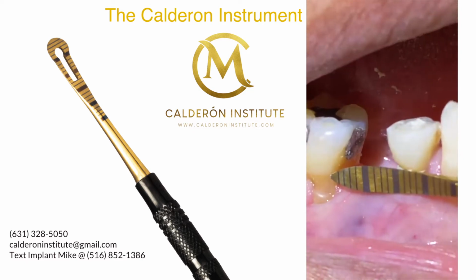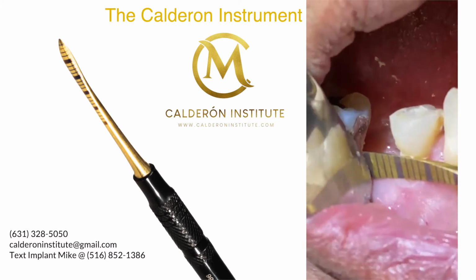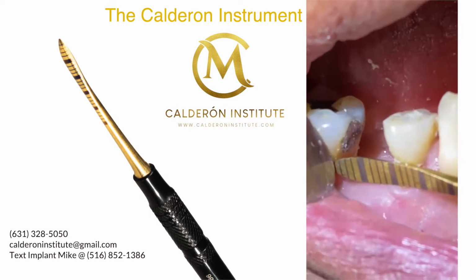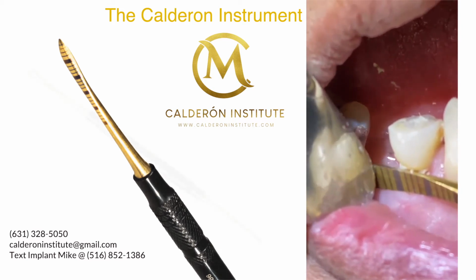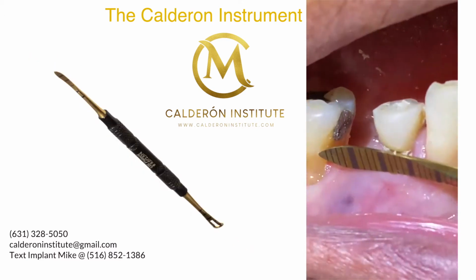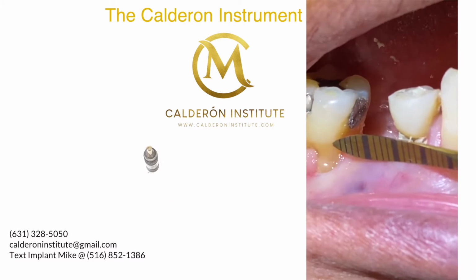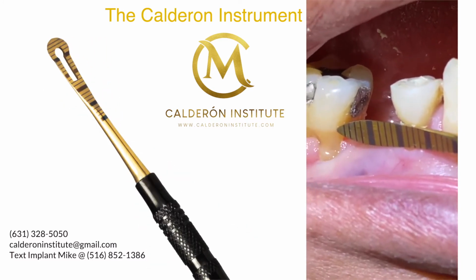When you see each line, G, can you see each line clearly? Yes, I can. Okay, so the thick line right here is 5 millimeters. The top of the thick line is 6. So you're going to go 1, 2, 3, 4, 5, 6, 7, 8, 9, 10. So just to the naked eye, I'm counting 9 or 10 millimeters. It is not 14. So that means we're only going to place one implant.